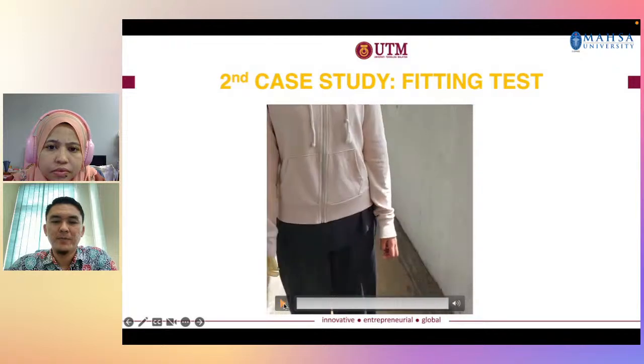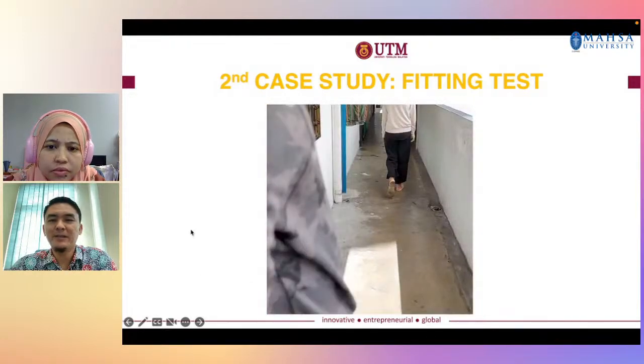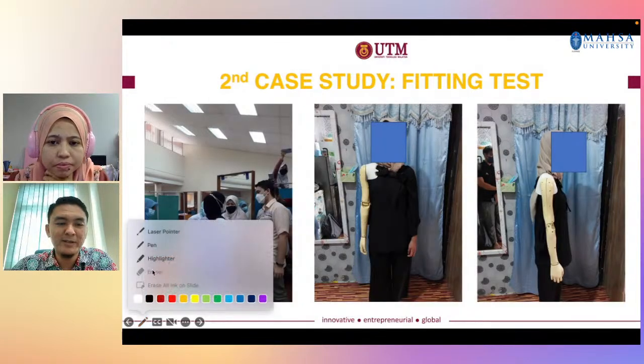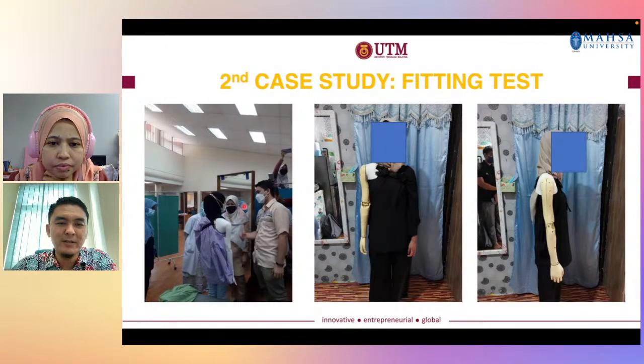Okay, this is the fitting test that we have conducted together with the medical doctor. We do have a medical doctor here, a physiotherapist actually, a medical specialist on rehabilitation. So she assists us, and she asks about the condition of the patient when the patient uses the prosthetic hand, because the patient is a first timer, a new user of the prosthetic hand. So we have to get some feedback from the patient and also from the medical practitioners as well.